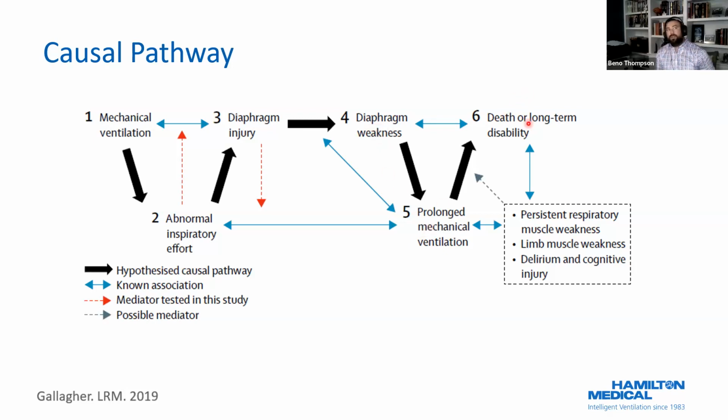And then either ventilator dependence, can't get them extubated, you have to trach them, or even death. There have been a couple studies that have come out in the past few years that link high asynchrony indexes to mortality. So over time, this has been known to contribute to mortality.